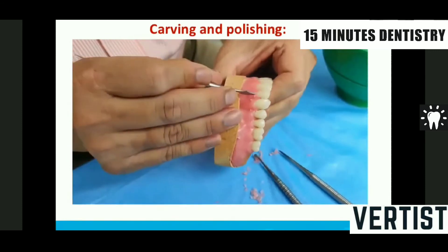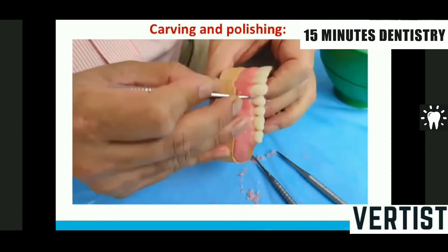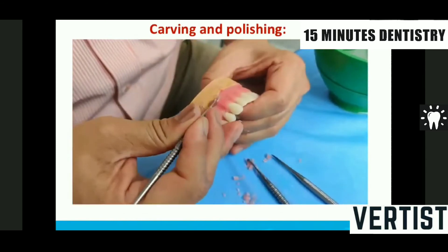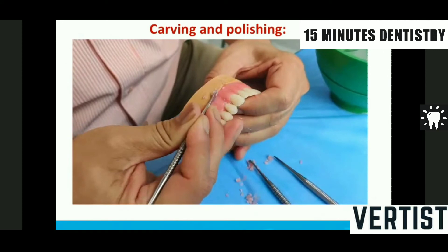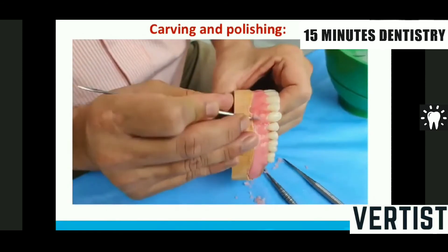In the canine I make the root more prominent to give the canine eminence. This canine eminence is very important to provide lip support at the corner of the mouth. If the canine eminence is absent, there will be a depressed look in that area, which will make the patient look aged.